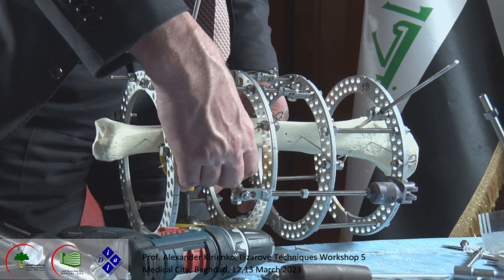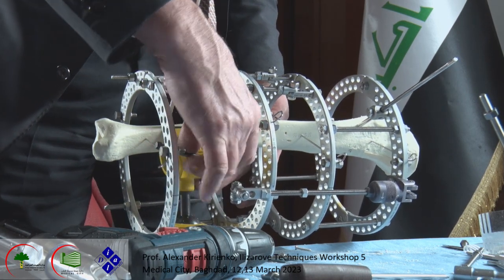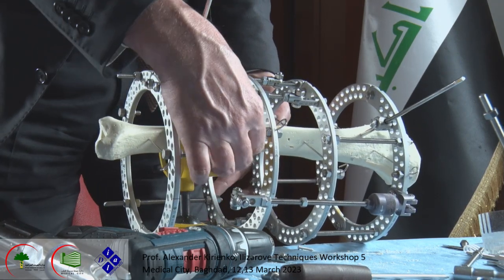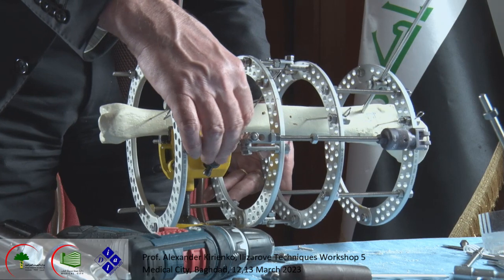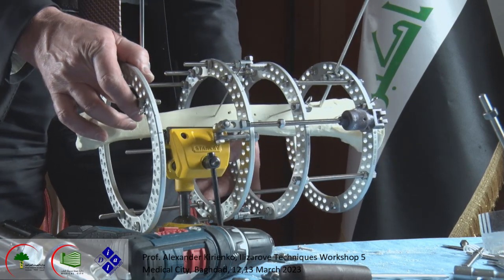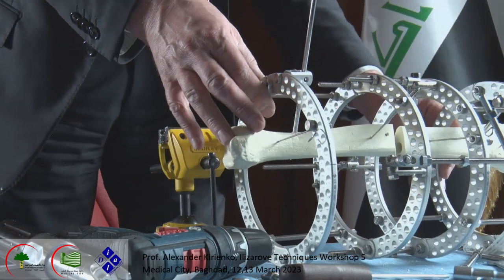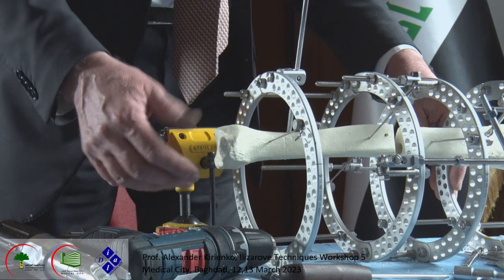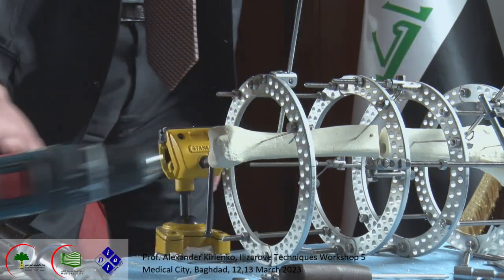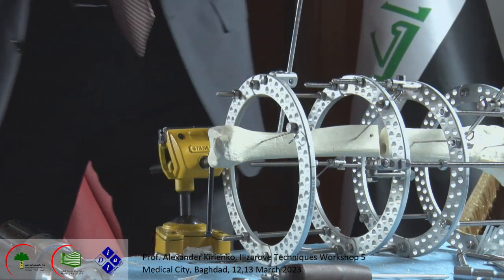Maybe I put it just a little bit like this, because the system is a little bit externally rotated. Now better, but not easy. I don't know if you see the same like this. Now it's completely corrected. Remove this.